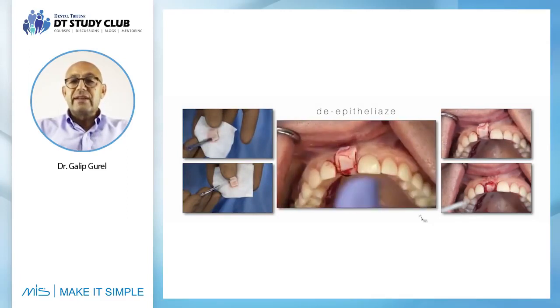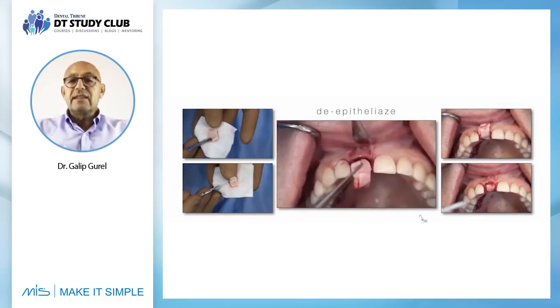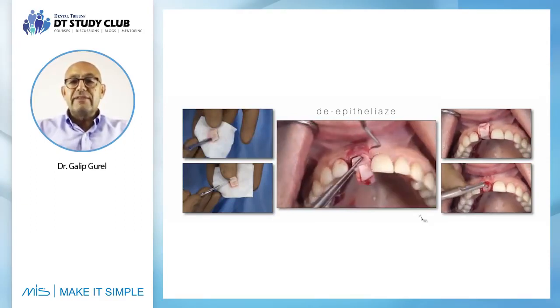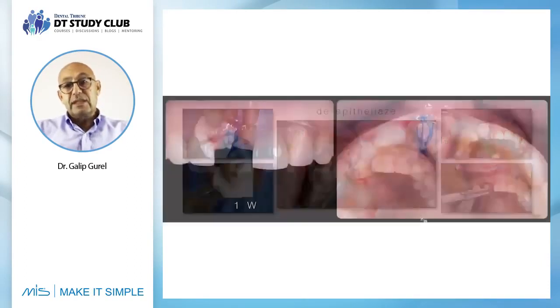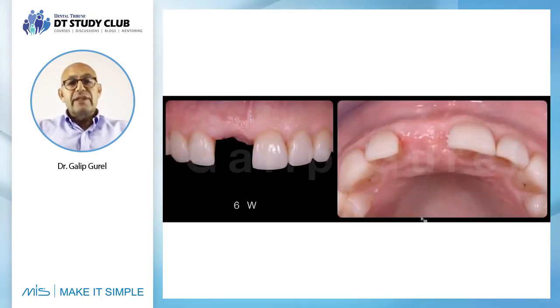And once he slides the wings, per se, inside the socket, he sutures them, and it's a very safe barrier to protect the implant in its position. So this is a few weeks later. We see the start of healing. At 6 weeks, it's pretty much healed.